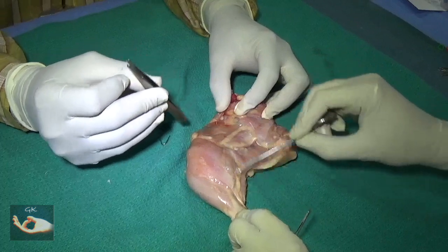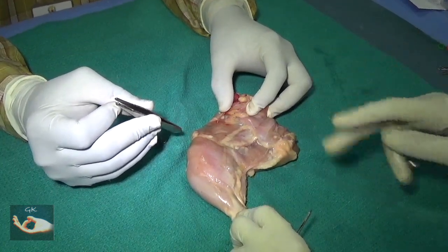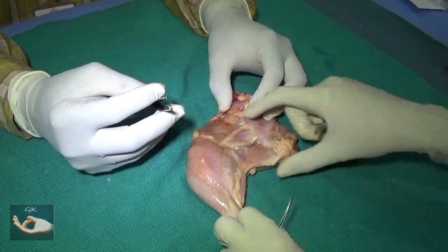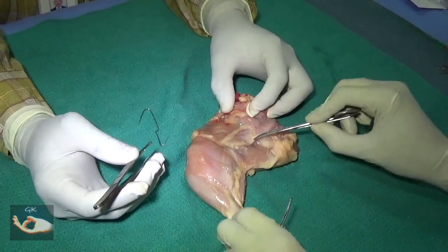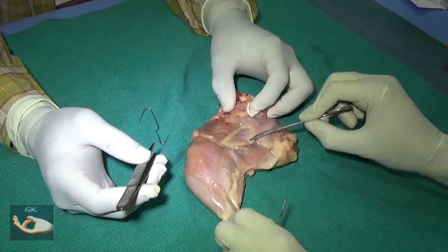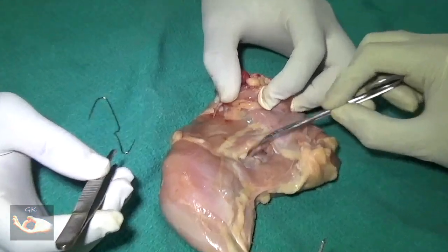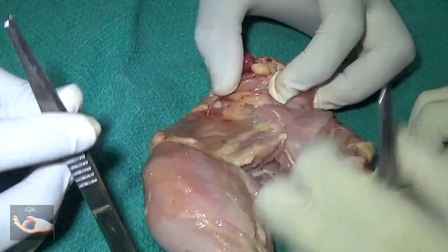In the chicken lower limb specimen that has been given to you, there are two portions: the thigh portion and the leg portion. On the thigh portion, you will note a muscle on the medial-most aspect and a group of muscles on the lateral aspect, with a groove between the two. In this groove lies the femoral nerve and the femoral artery of the chicken leg.